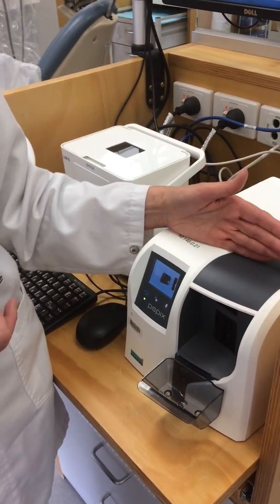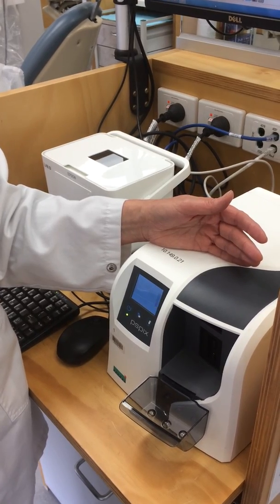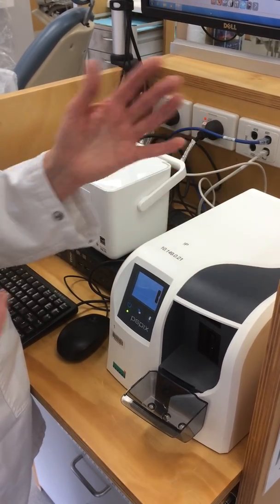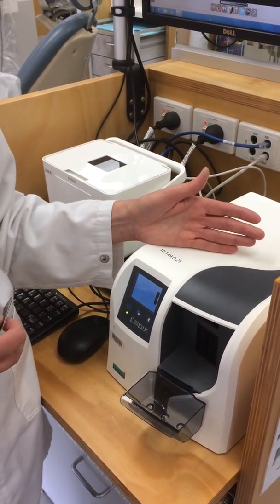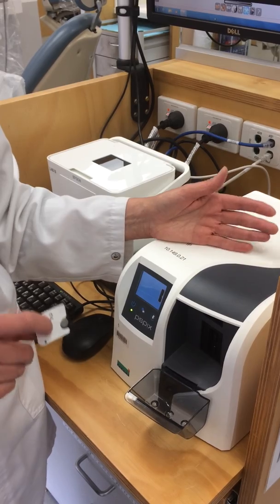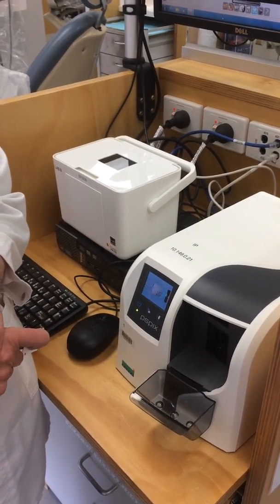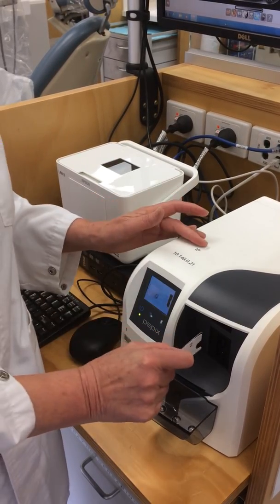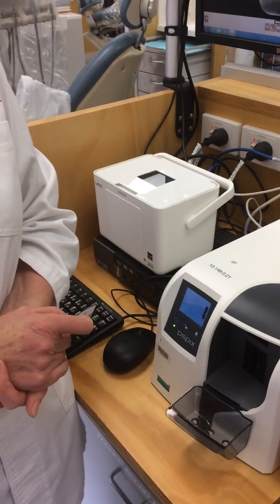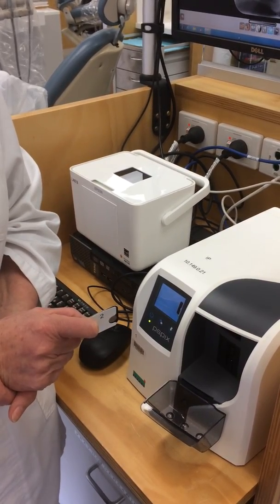This can cause the machine to stop, and then the machine has to be taken apart for the phosphor plate to be removed. The worst case scenario is if it can't be taken apart by the staff here and it has to be sent to Melbourne — it can take weeks before it's returned, and then we don't have any processor available for your training. So please look after these phosphor plates, look after the processing machine, and make sure you follow the correct process when exposing and processing a film.